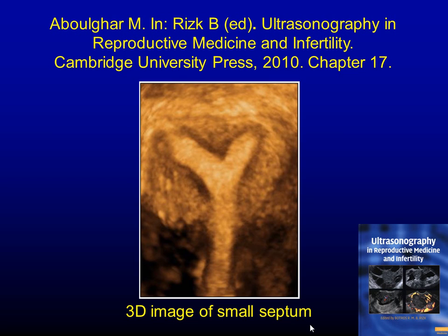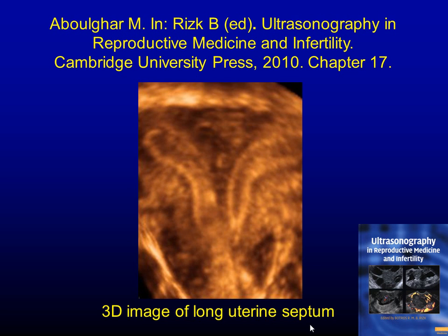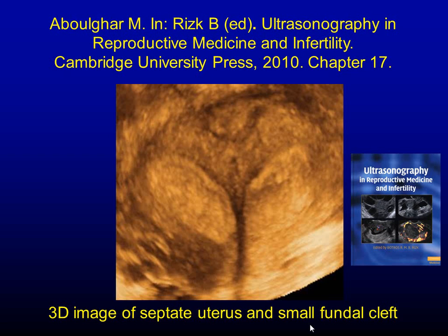We have just actually compiled a series of 68 cases of resection of uterine septum, where we divided them with the scissors, and in 5 of them we also removed the tissue of the septum. Although the surgery is called resection of the septum, resection implies that you've taken it out. Really, with the scissors, you do not take anything out. You're just simply putting the septum on a stretch with water, and then cutting in between those. Again, this is another septum dipping in the middle of the uterus, a third one here.